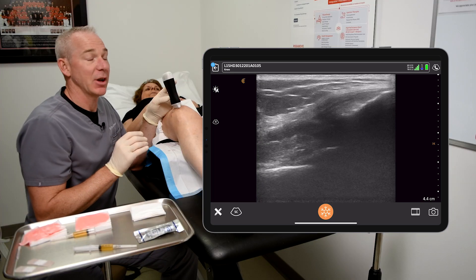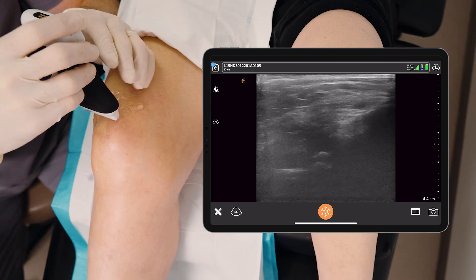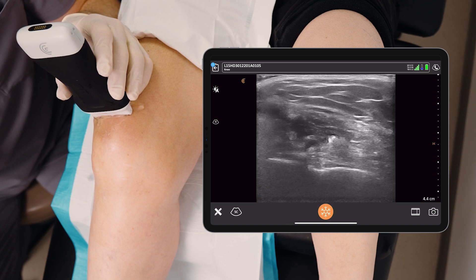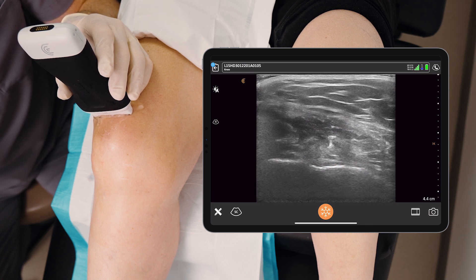I'm pretty confident about this one. What we do here is we simply rotate the probe 90 degrees. I've got a little bit of sterile gel here just to make my job a touch easier. Once again, top of the screen is the quadriceps tendon, bottom of the screen is the femur, and in between is the suprapatellar fat pad and pre-femoral fat pad.